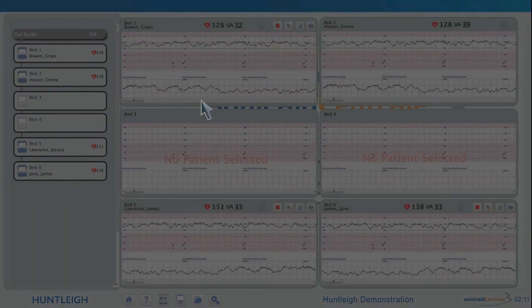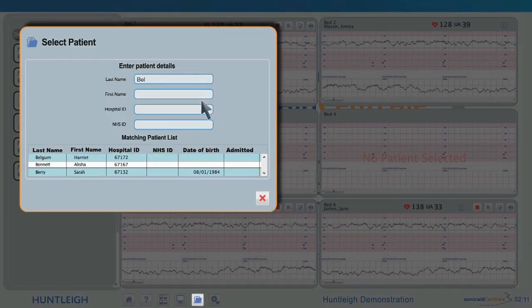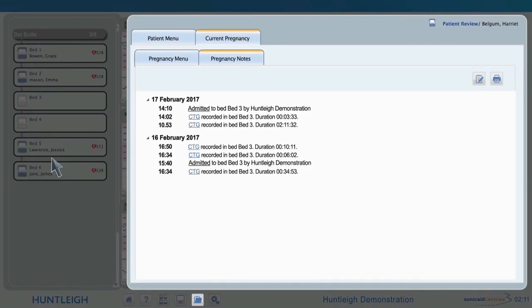Stored records can be opened by clicking on the folder button at the bottom of the screen. Once the patient has been located by ID number or name and selected, the records can be opened. A list of traces can be displayed, and traces can be opened by clicking on the respective CTG and printed or viewed as required.